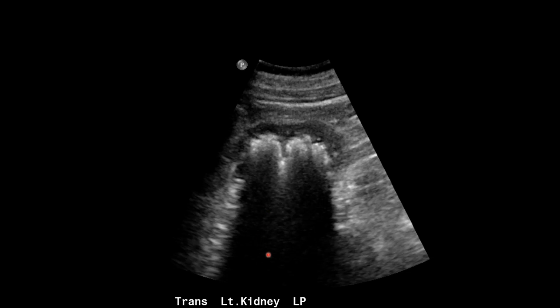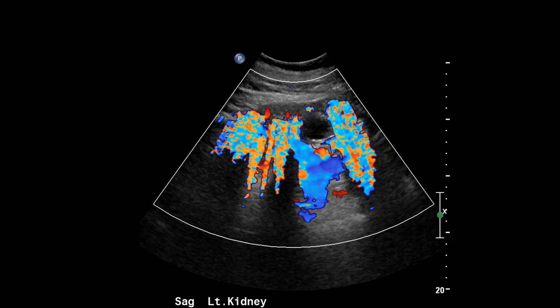Again, look at how dense that posterior acoustic shadowing is on this transverse image. When we add color Doppler, we see marked twinkle or twinkling artifact. It almost looks like turbulent blood flow, but it's actually due to the fact that the ultrasound beam is hitting these dense calcifications and getting distorted. Notice also that the focal zone is actually positioned below the area of interest, and that's a way to maximize twinkle artifact on color Doppler.